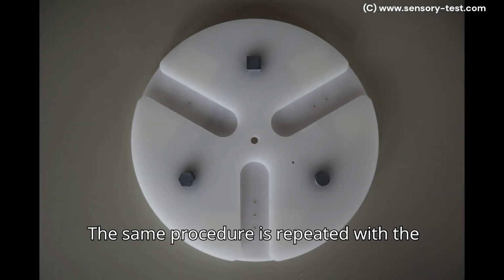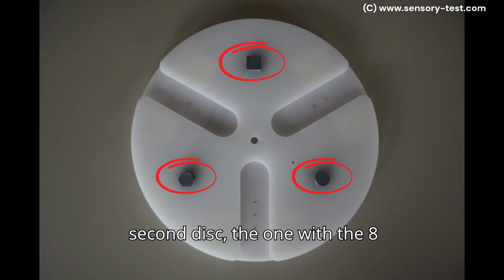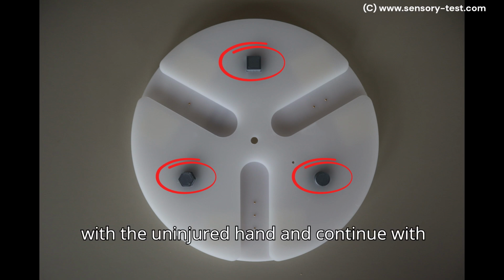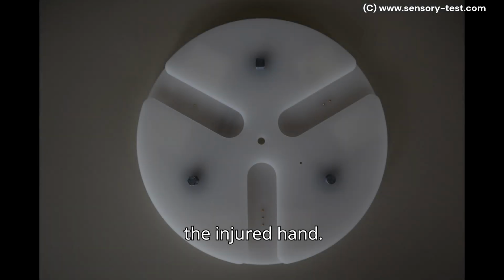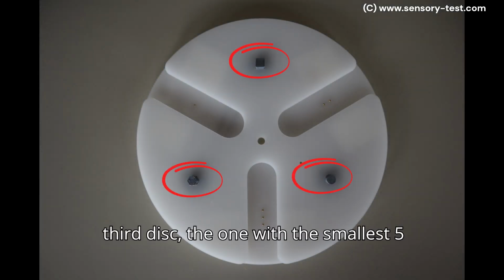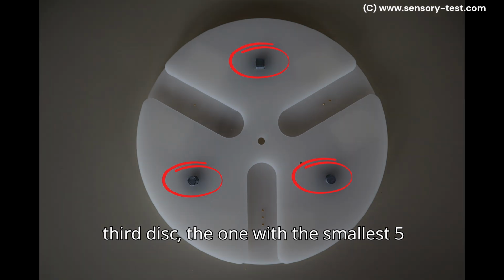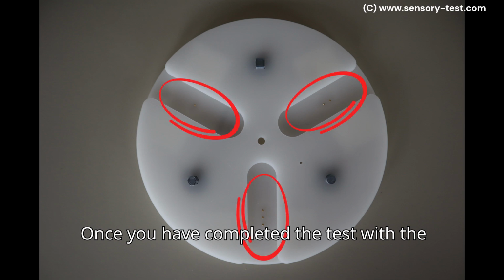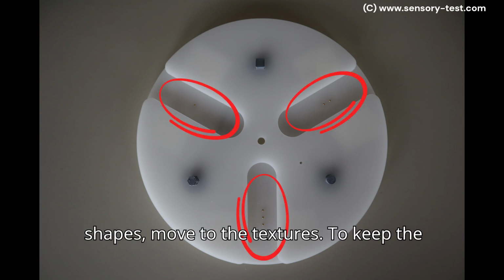The same procedure is repeated with the second disc, the one with the 8mm sized shapes. Again, begin with the uninjured hand, and continue with the injured hand. Finally, repeat the procedure with the third disc, the one with the smallest 5mm sized shapes. Once you have completed the test with the shapes, move to the textures.